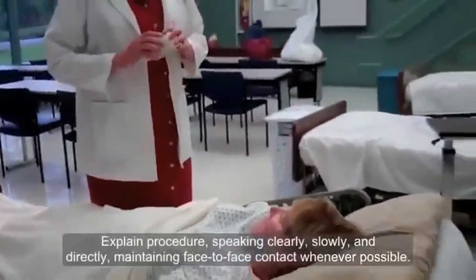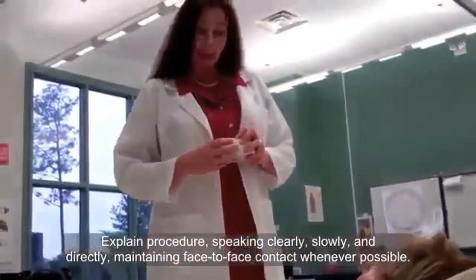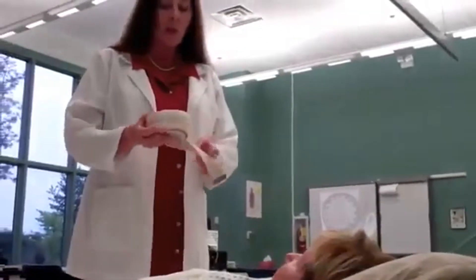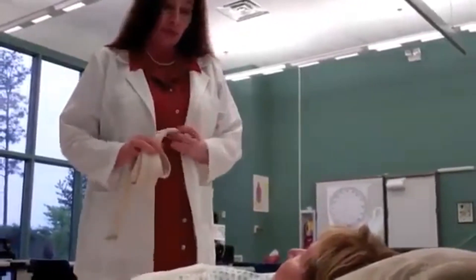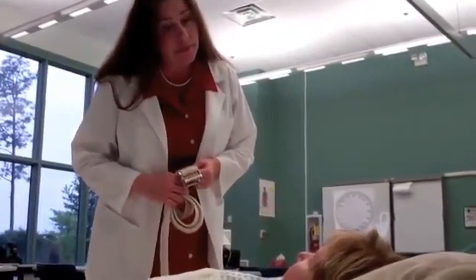Come in. Good morning, Ms. Rice. How are you? I'm fine, thanks. Well, good, I'm glad to hear that. Listen, the doctor has asked me to go ahead and take you for a little walk. We're going to ambulate you — that means walk — for about 10 feet. And in order to do that for safety, I'm going to use this gait belt, this transfer belt. Is that okay with you? That's fine.